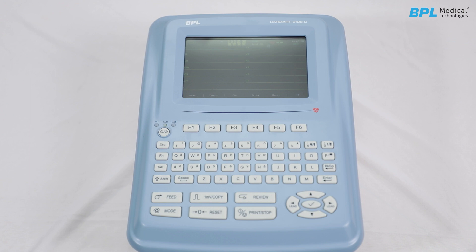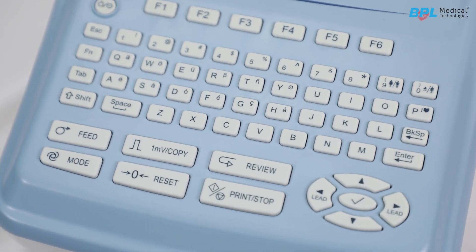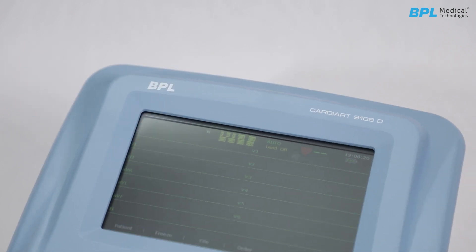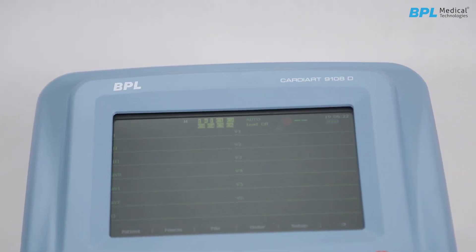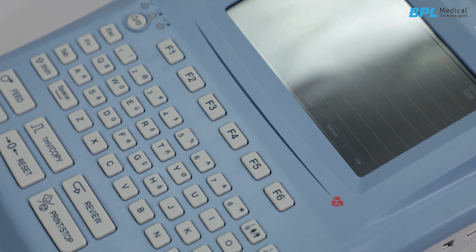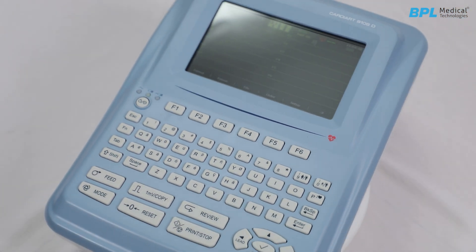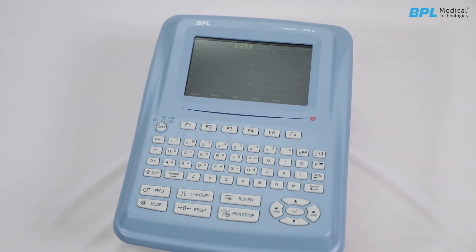If the machine will not be used for an extended period, it is recommended to perform periodic maintenance. Always follow the recommendations and safety protocols to guarantee the accuracy and reliability of the ECG record. This concludes the process of unpacking and operating the BPL ECG machine, Cardiart 9108D. Thank you.